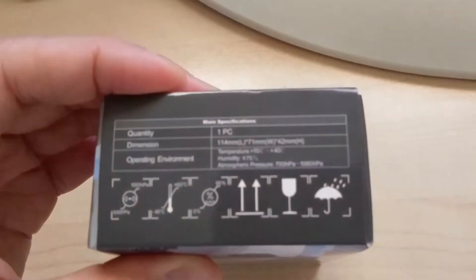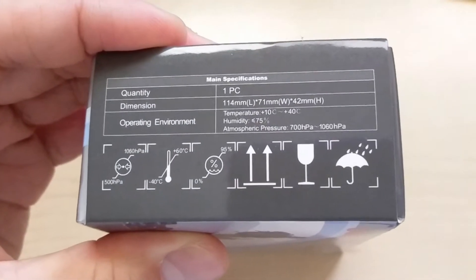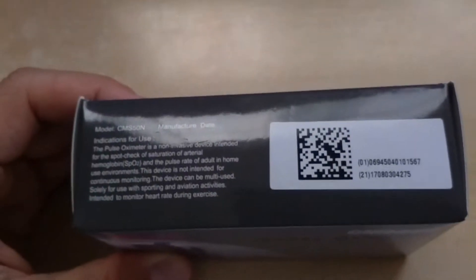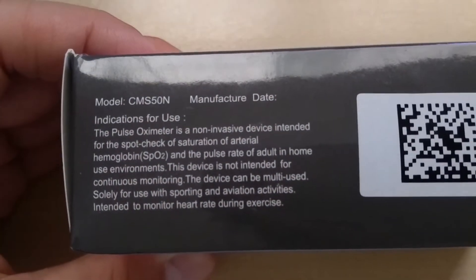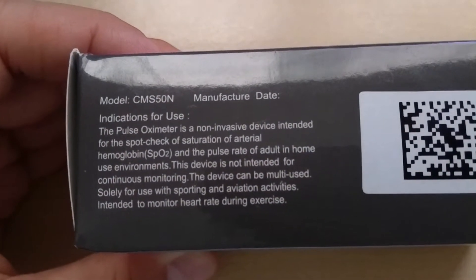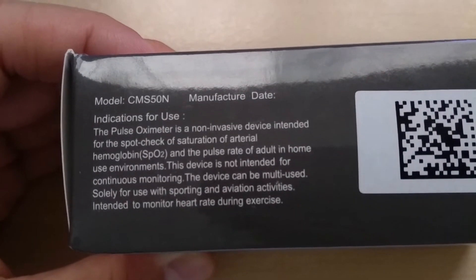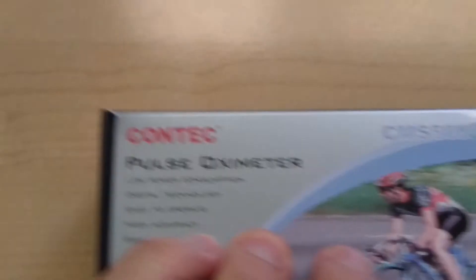The other thing to keep in mind is the operating environment — we want to make sure we're working within that operating environment just for accuracy purposes. This is model CMS50N and it's meant to be used with your finger. You just slip your finger in and it will get your pulse oxygen saturation percentage and also your pulse. So let's open it up and see what's included.